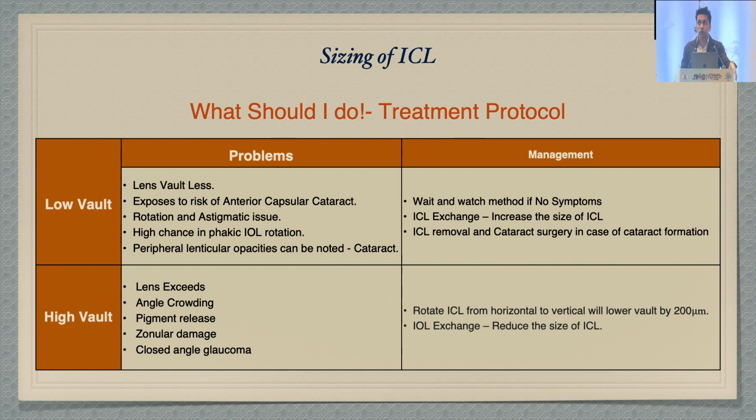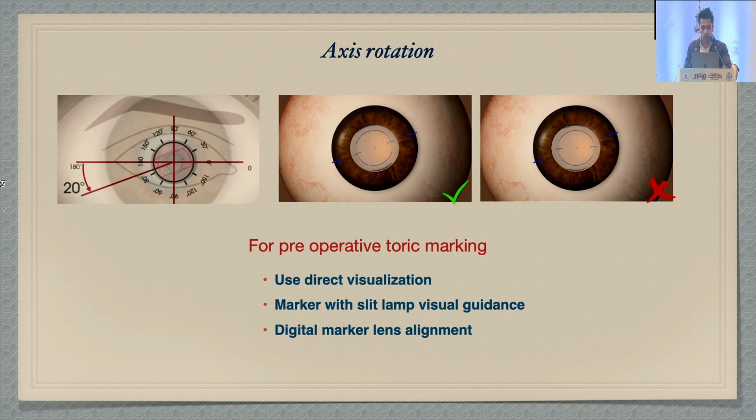Just go one size lower. Unfortunately, the sizes, as I showed you, are in 0.5 steps and not smaller. I wish they were smaller. We would have used that as well.